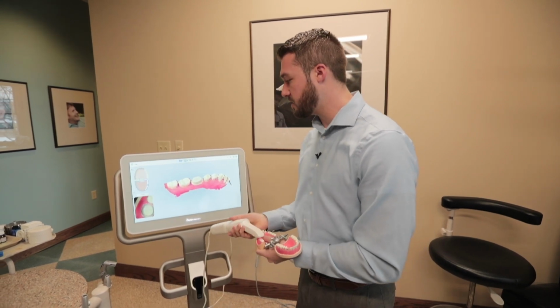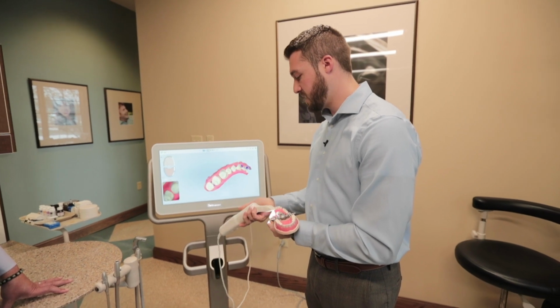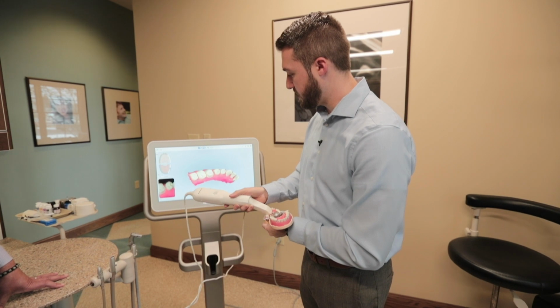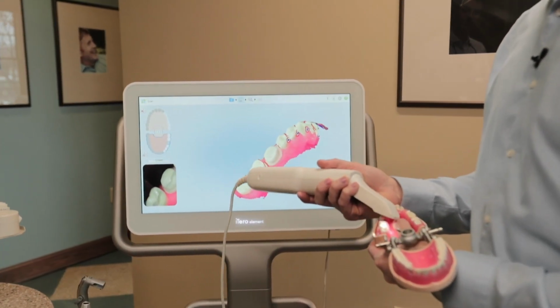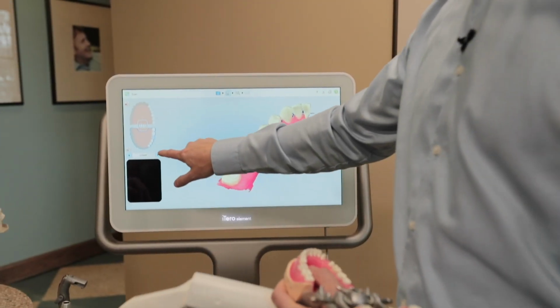So now I'm going to turn on the scanner and I'm only going to be filling in those areas. Here I'm just going to try to get my mesial contact as much as I can. I'm going to rock this way, get my distal contact, and just take a quick look again. All right, it turned tooth colored, we're good to go. Then we would go to the next.